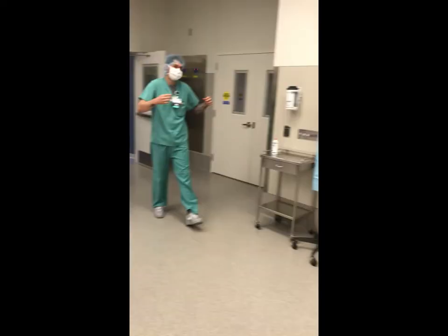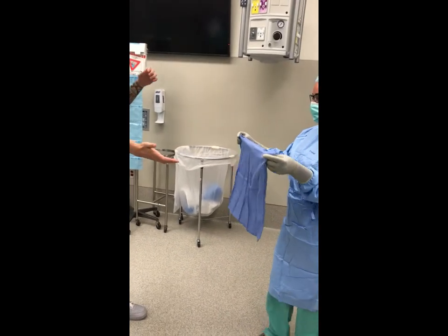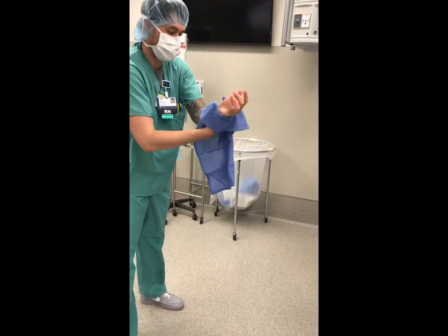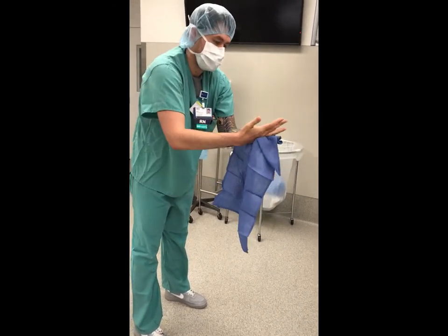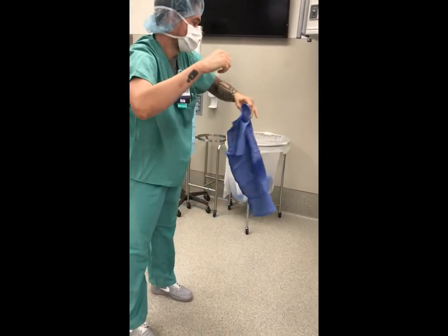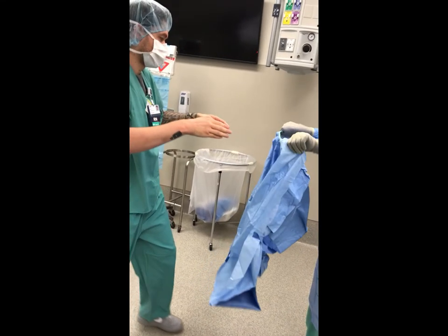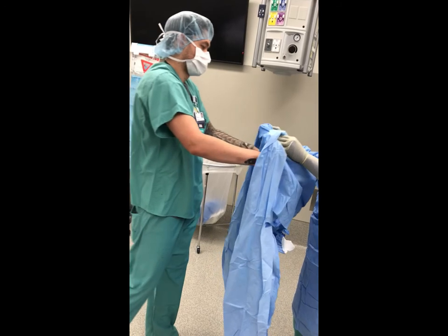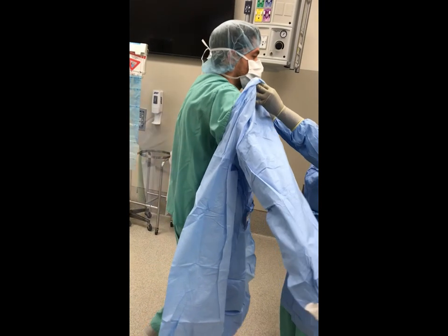A gowned and gloved individual may assist another individual in donning a sterile gown. The scrub person who is already gowned and gloved hands the newly scrubbed person a towel to dry their hands and forearms, unless an alcohol-based surgical hand rub was used. The scrub person picks up the sterile gown and opens it with the inner side towards the individual to be gowned. A cuff is made of the neck and shoulder area to protect the gloved hands, and the gown is held until the person's hands and forearms are in the sleeves.